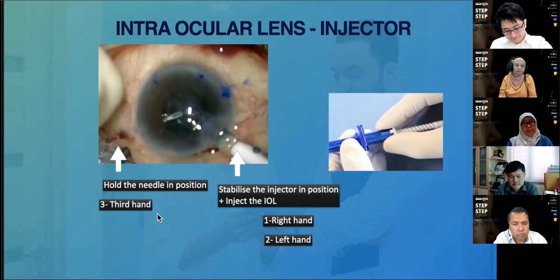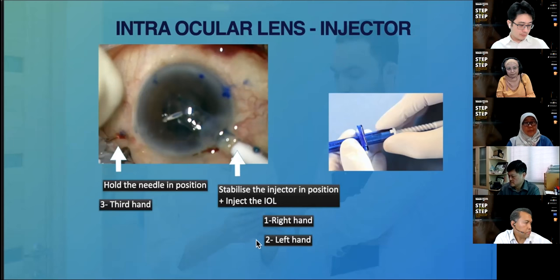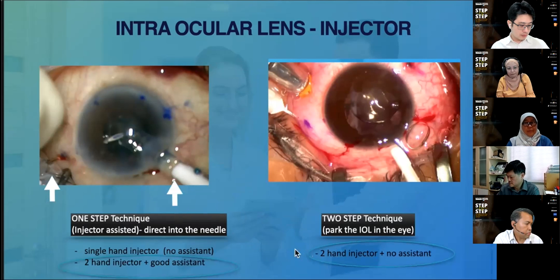Again, we can do this if you have a reliable assistant. He or she can either hold the needle in place for us or help to screw in the IOL. But then what happens if you don't have the assistant all the time? So we have various options. If we happen to have a screw type of injector with a good assistant, probably we can do the single step injecting technique.